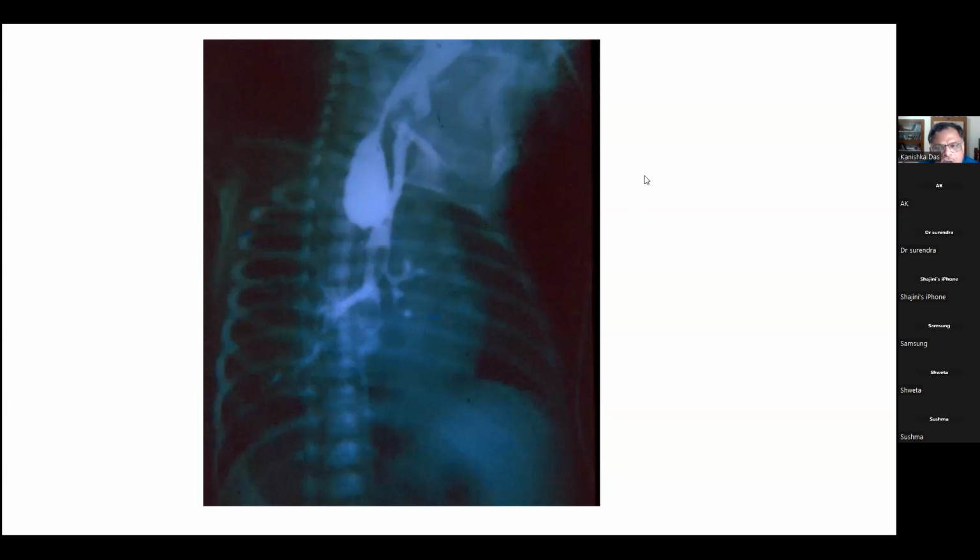Why is this contrast not something else? It can be normal aspiration also, sir, when doing an oral contrast study. But they were close to each other, abutting. That is why I felt it, but there is less chance of an upper pouch fistula. So how would you say that this is aspiration or fistula from this picture?